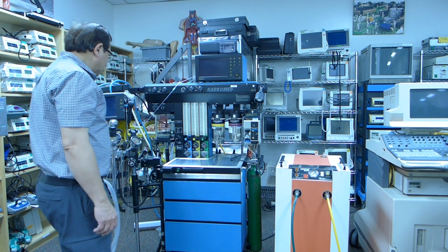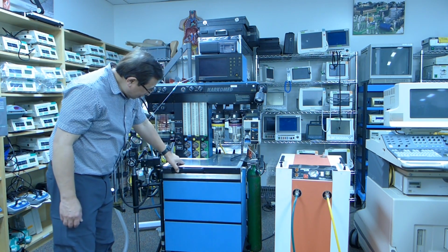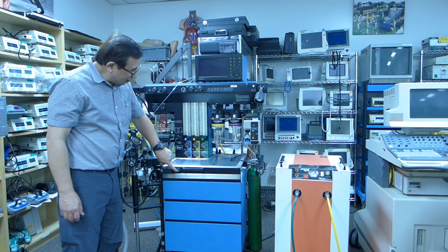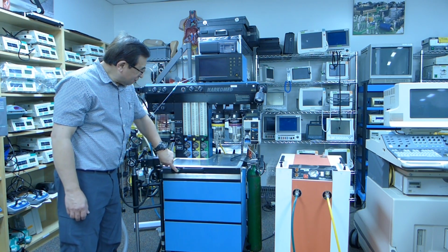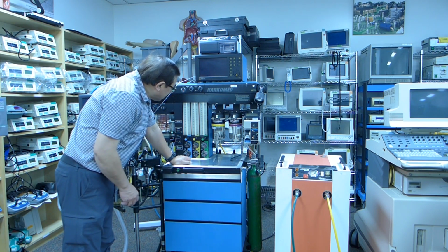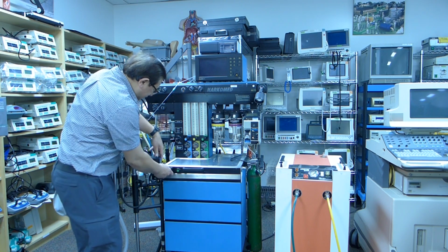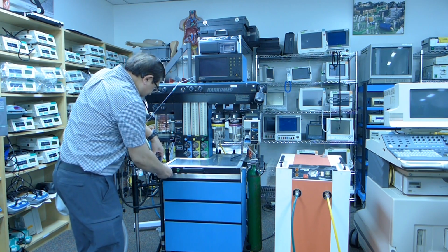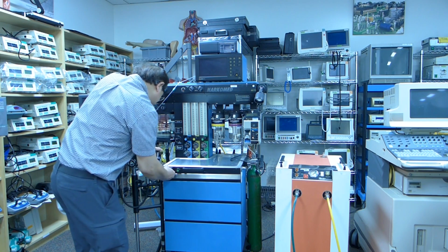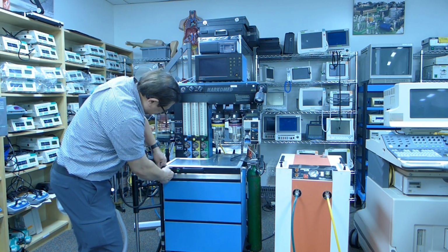If you can see here in the front, another thing is the oxygen flush system. And the fresh gas supply hose over here.